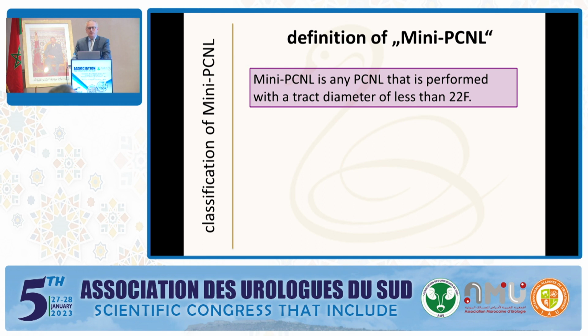From my point of view, it is suitable to have a definition of mini PCNL which tells us first that this is a mini PCNL, and mini PCNL is any PCNL that is performed with a tract diameter of less than 22 French. Once more, mini PCNL is everything percutaneous with a tract diameter less than 22 French.